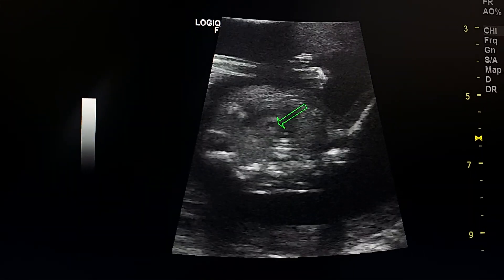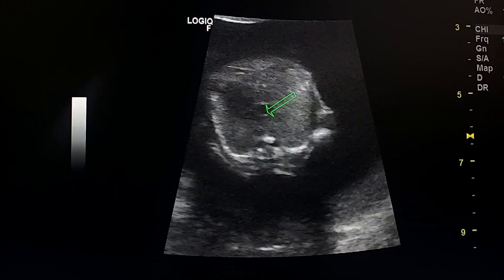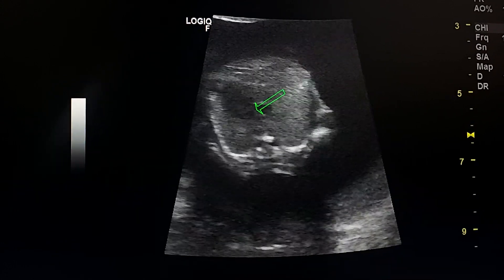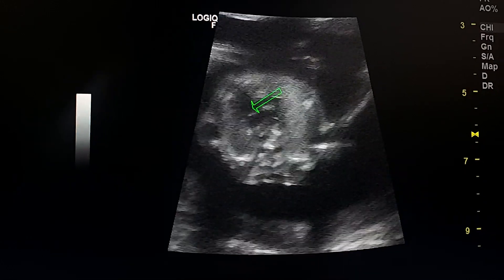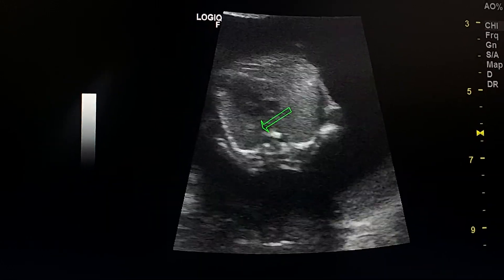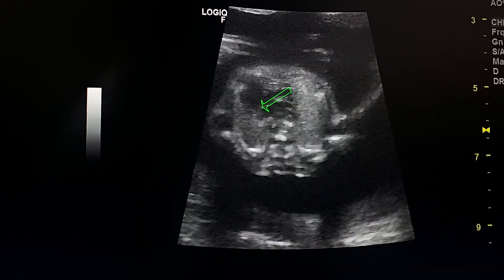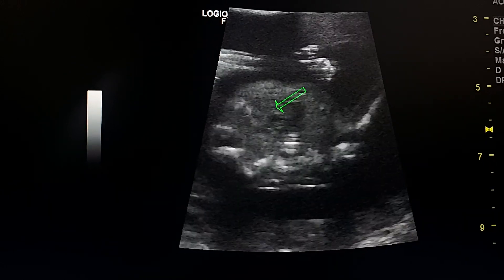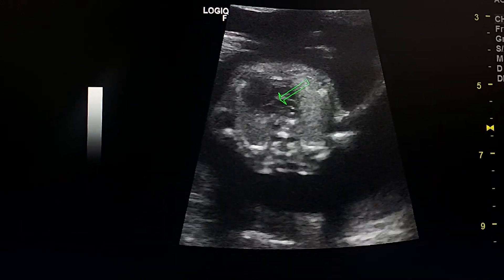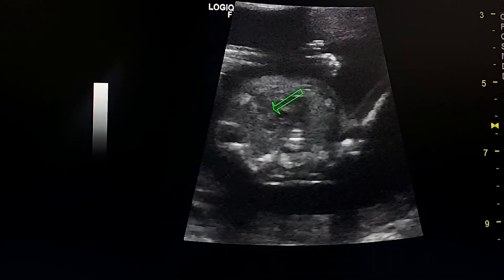In this four-chamber view of the heart by linear probe, this is the left ventricle, this is the left atrium, and this is the mitral valve. Here we don't see a normal-sized right ventricle, and we see a VSD.